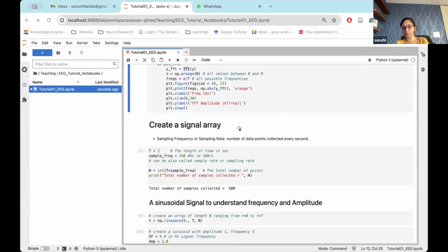Here I'm changing the phase. So it's basically just shifting the signal. Okay, so here the amplitude is the same, the frequency is the same. I'm just shifting it. So at 0, this was something else. This was 0. This was something else. That's all we're changing. We're just shifting.